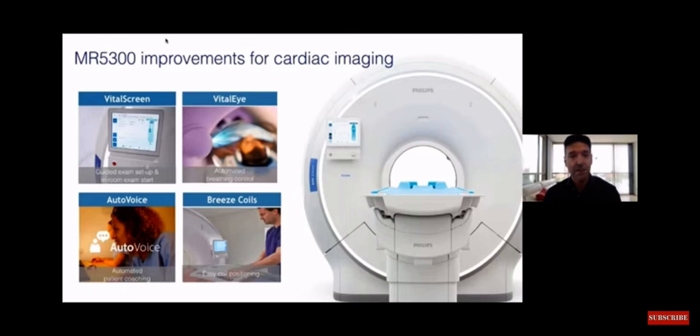And finally, cardiac MRI is special. It requires ECG synchronization and acquisition of images during respiratory apnea. So this implies giving the instruction for each apnea slice by slice during approximately 45 minutes, and that is only one of the 5-6 studies that are performed in each session. So think about it. These people spend 5-6 hours a day giving the same instruction over and over again. So the auto voice not only preserves the mental state of the technicians, but also allows time to be optimized, and the next sequence to be programmed on the fly.